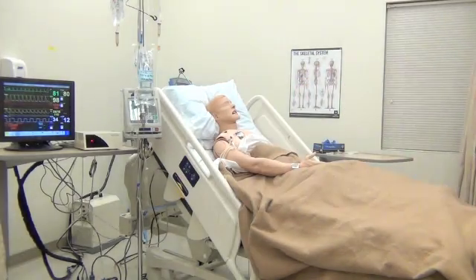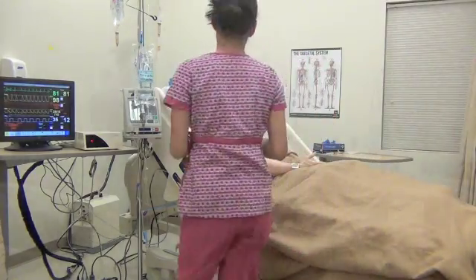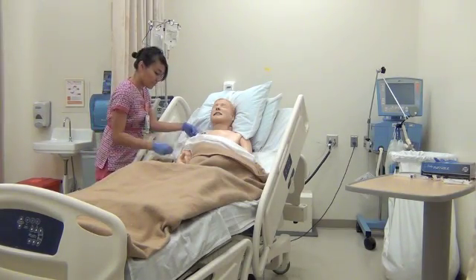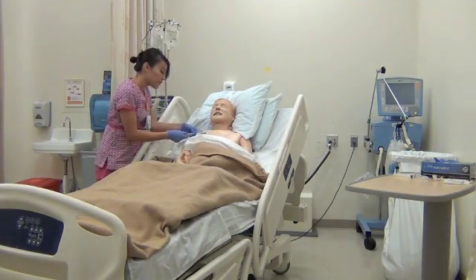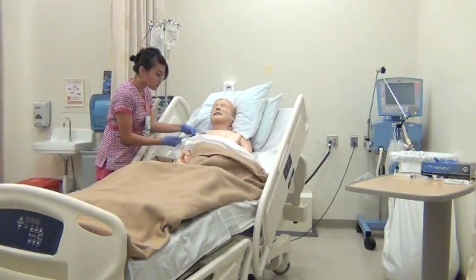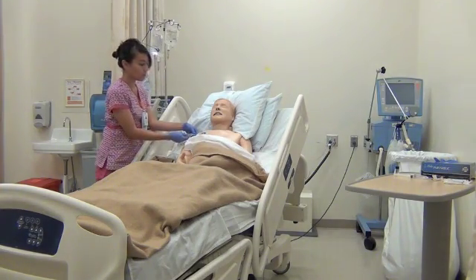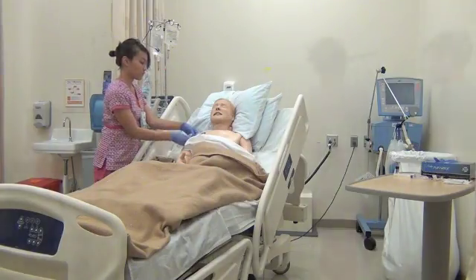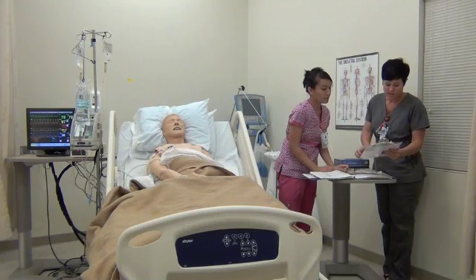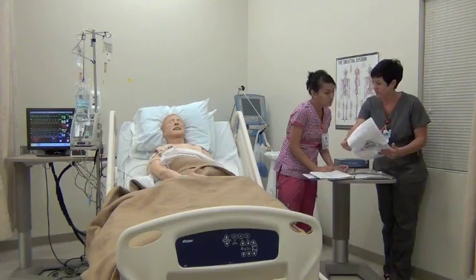The nurse is preparing to administer a medication to a patient with a central line. As the nurse flushes the line, she meets resistance and realizes the line is occluded. The nurse then makes her charge nurse aware and asks for the policy regarding thrombolysis of central lines.